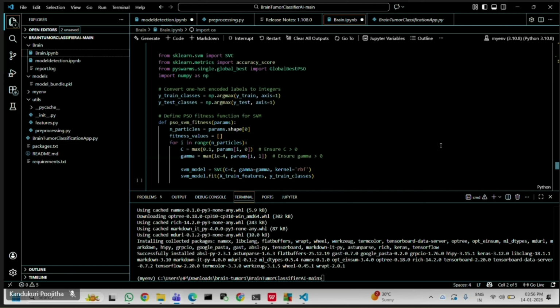We included SVM with GLCM features in our project, and it really provides good accuracy and low loss. As we know, if accuracy is higher, loss will be very low, which means our model is working fine.